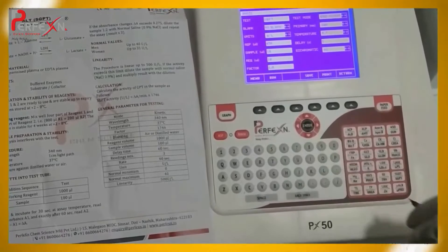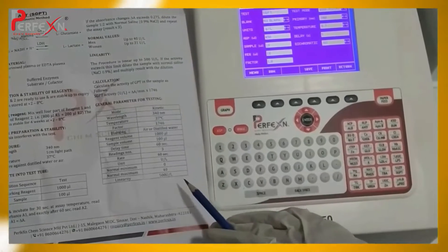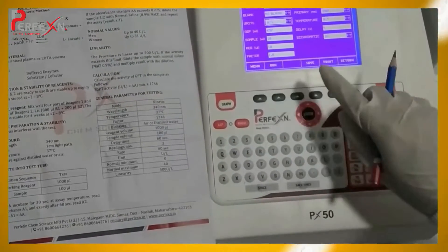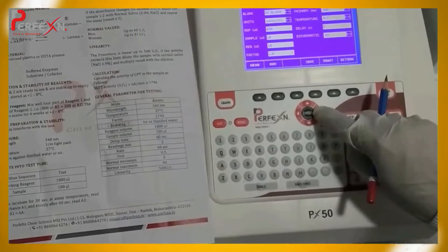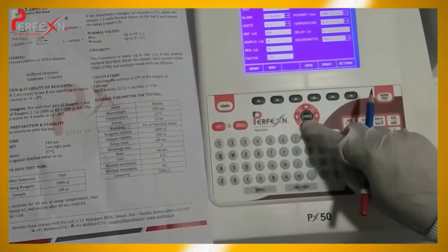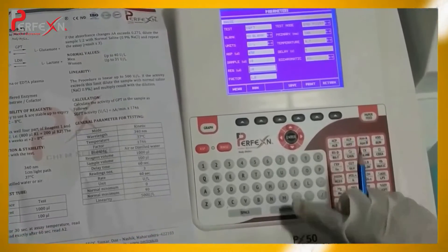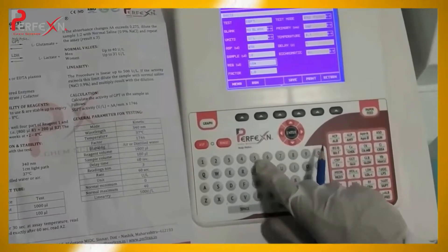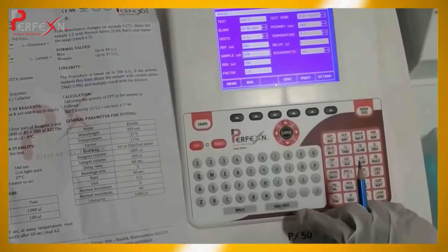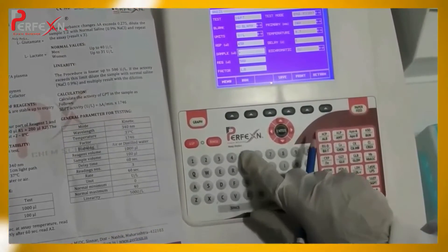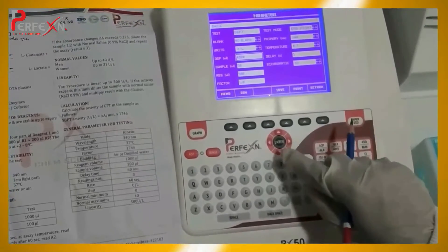Now go to the units. On the literature, you will see the units given are units per litre, so enter units per litre. Now go to the reagent volume. We have to adjust to 500 microlitres, as I am performing in the half ratio. The sample volume is to be 50 microlitres, and the estimation volume performed by the analyzer is up to 450.